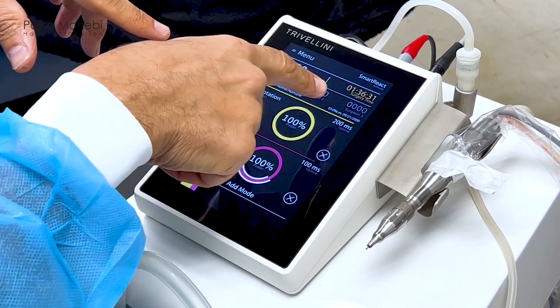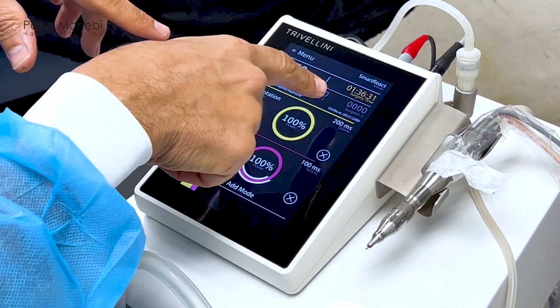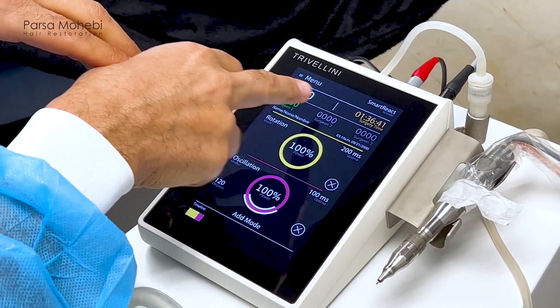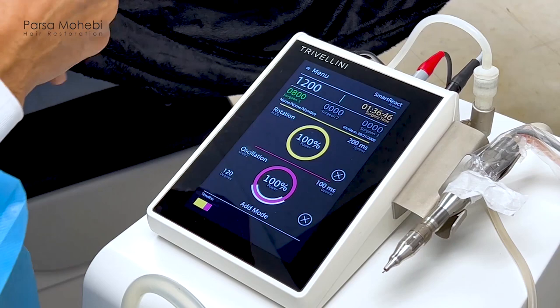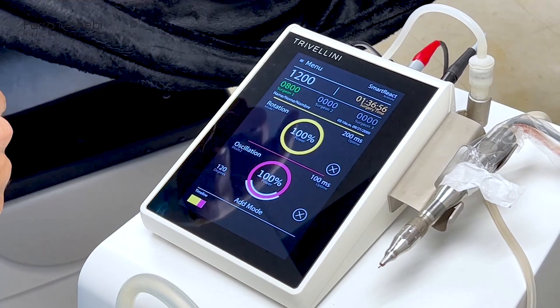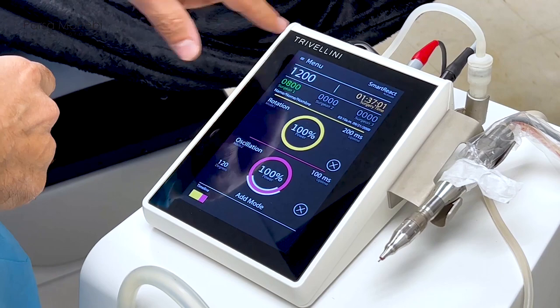Going higher on the interface, we see the time from the beginning of the procedure — marked from when you turn on the machine to the current moment. On the opposite side is the number of grafts, which is the goal set for the day. That number counts down as we extract more, showing how many more we have to go. So if the whole procedure is set for 2,000 grafts and we've already removed 800, we have 1,200 more to go.